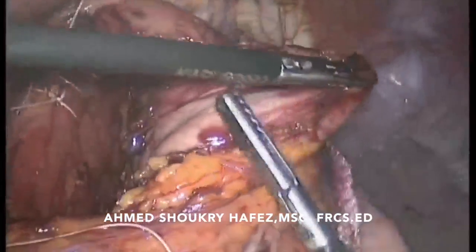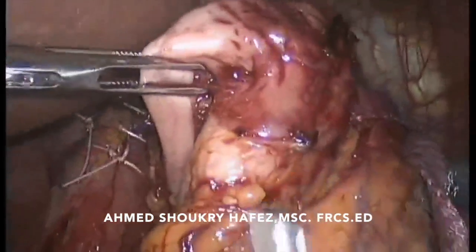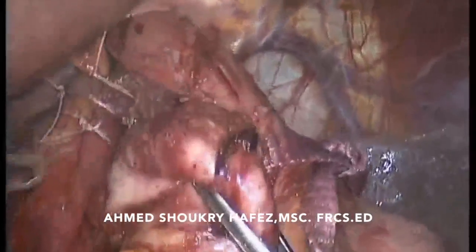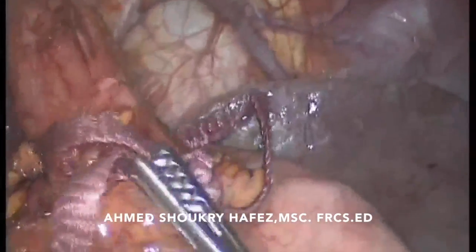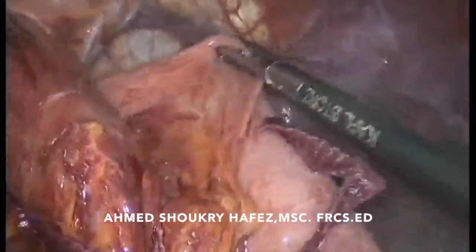Now we pass the wrap posteriorly and see exactly where the wrap is going to lie around the esophagus. One very important difference between the Toupet and the Nissen fundoplication is that in the Toupet we fix the posterior aspect of the wrap to the crura. It's one very important difference between Toupet and Nissen fundoplication. We must fix in Toupet the wrap posteriorly to the crura.